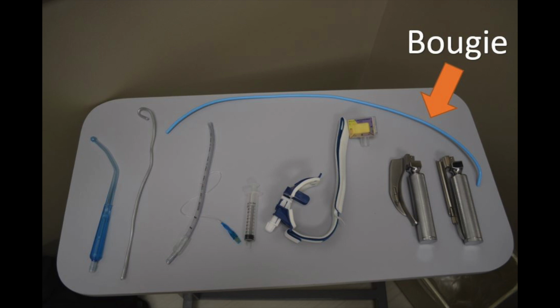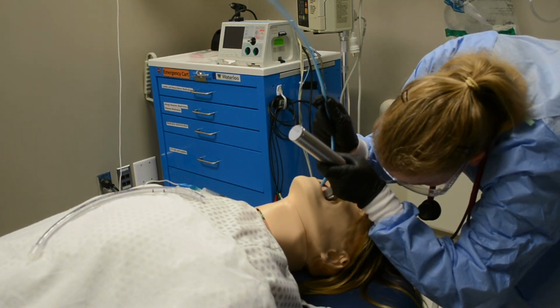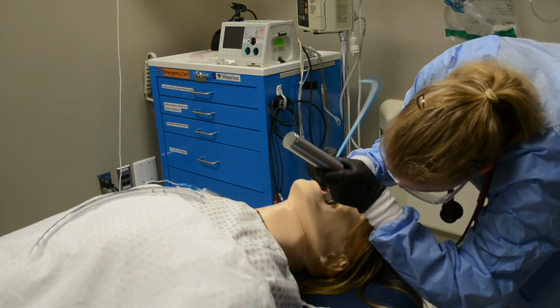You can apply cricoid pressure using the Sellick maneuver. This can avoid regurgitation of gastric contents and press the vocal cords down into view. Or you can use a bougie in case of a difficult airway. Insert the bougie through the vocal cords and then slide the ET tube over the bougie.